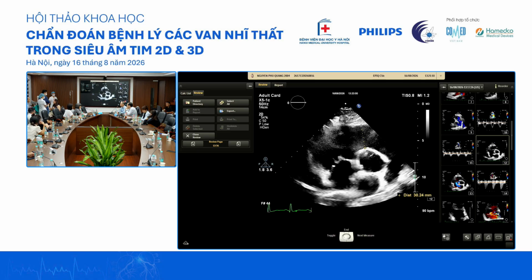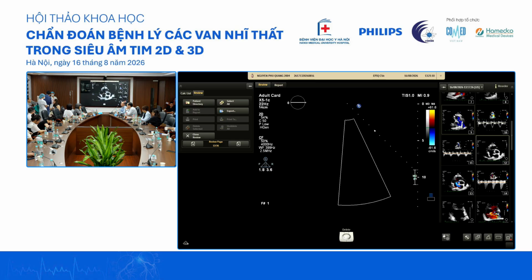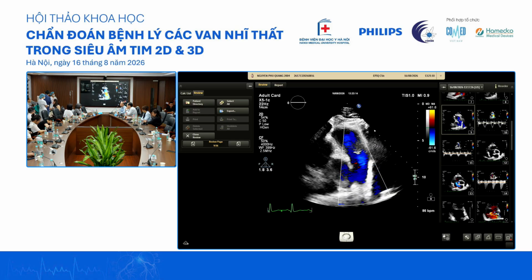So the other thing that we pick up is that you see a lot of tricuspid regurgitation without pulmonary hypertension. The pulmonary pressure, PASP, is a bit high. We may not have enough PR to do the assessment using Mahan's equation. Not much, yeah. So as Professor Kong suggests, we will routinely do a right heart catheterization to rule out a pre-capillary cause. But he's a man, so we have seen it, but it's very uncommon. It tends to be female.